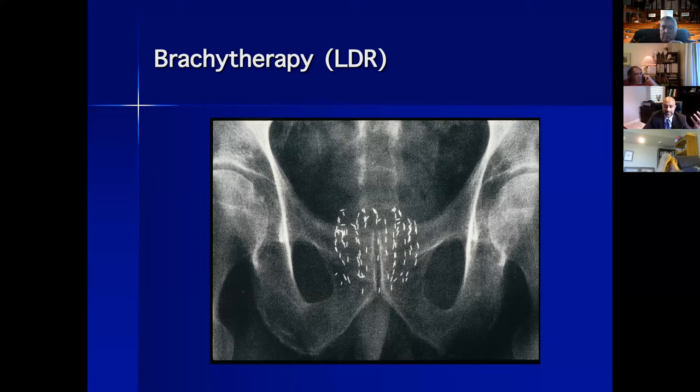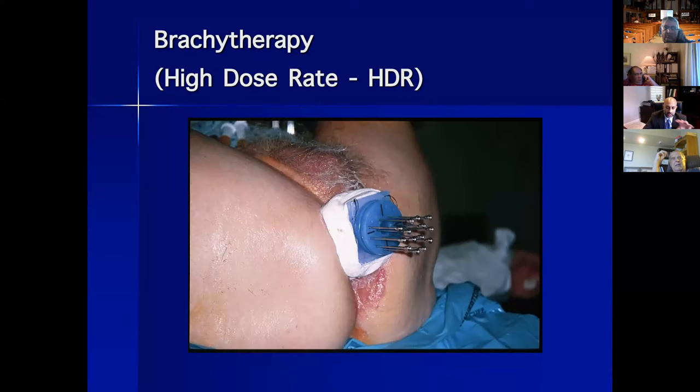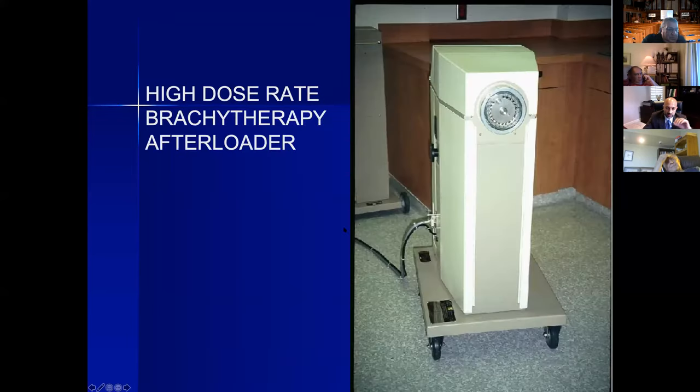Is there a newer technique that might work? And so that's when they came up with what's called high dose rate brachytherapy. And again, I apologize about this picture, but essentially what they said is, instead of putting a whole bunch of radioactive seeds there, they put a series of needles directly into the prostate gland, and I'll come off of that picture so that we're not dwelling on that while we're eating.